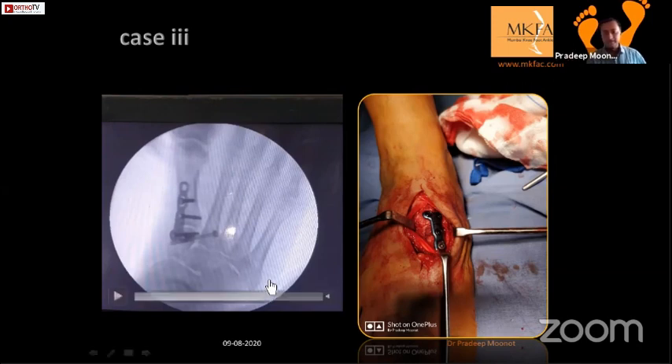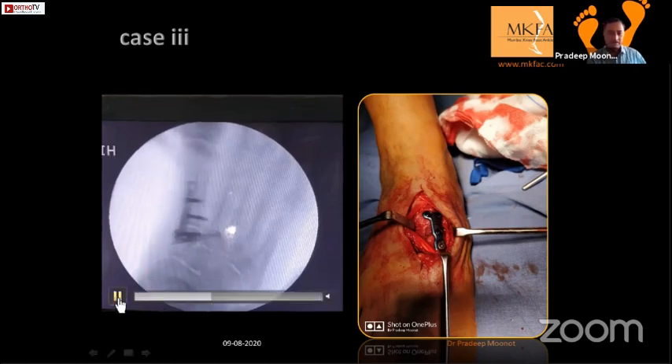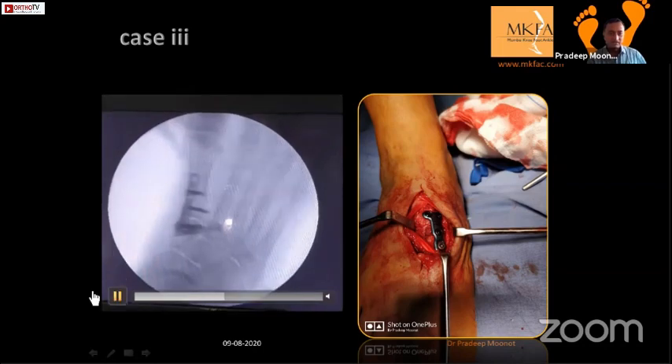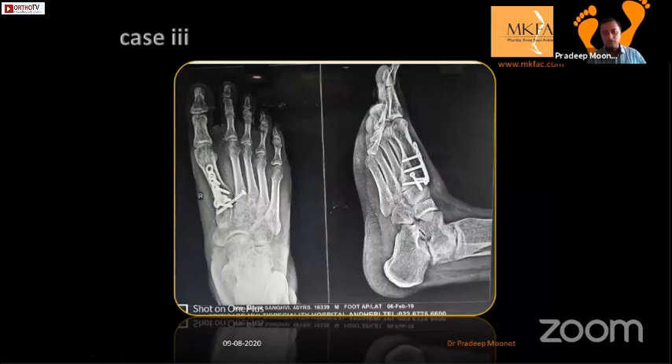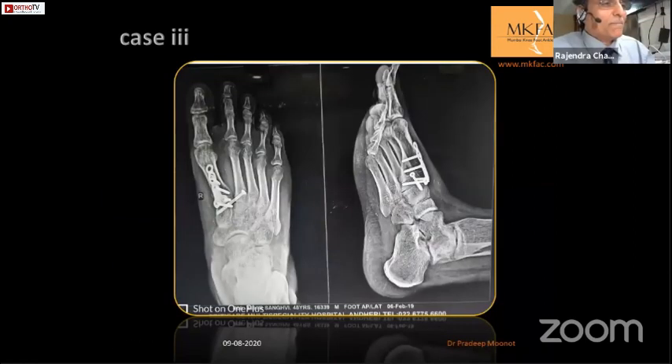Finally, this is the fixation - I showed you that movement here was a single full movement. The video is not playing properly, but the patient went on to do very well.